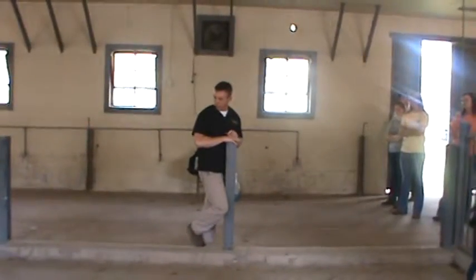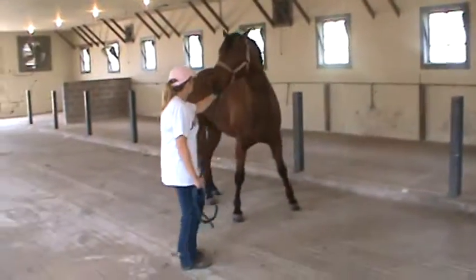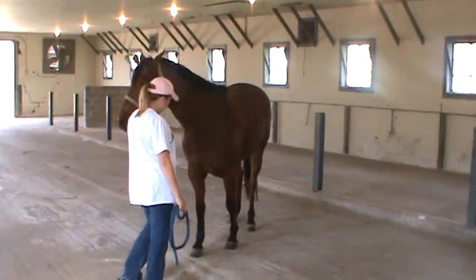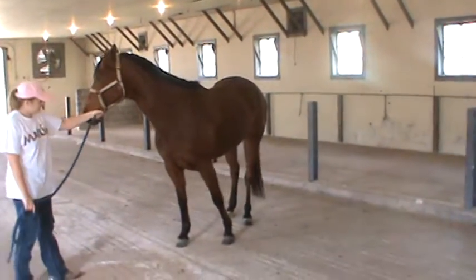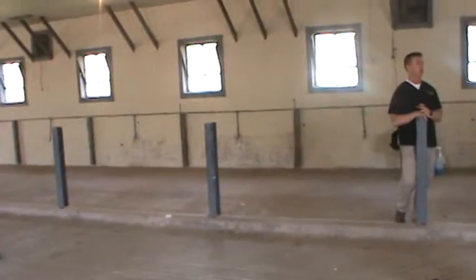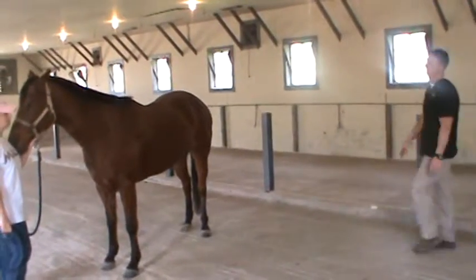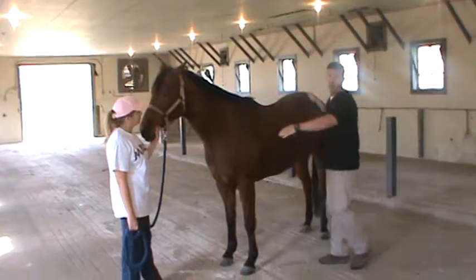So what we would do first is we would just make an attempt to evaluate this mare conformationally. Can you turn her sideways for me just a little bit? Thank you. I'm not trying to make horse judges out of you, but if you look at that mare, the first thing that a reproductive person is going to do is just look at her capacity to carry a baby. A veterinarian's job, a theriogenologist's job, that's doing the breeding status evaluation, is to look at, does this mare have enough abdomen to carry a baby?